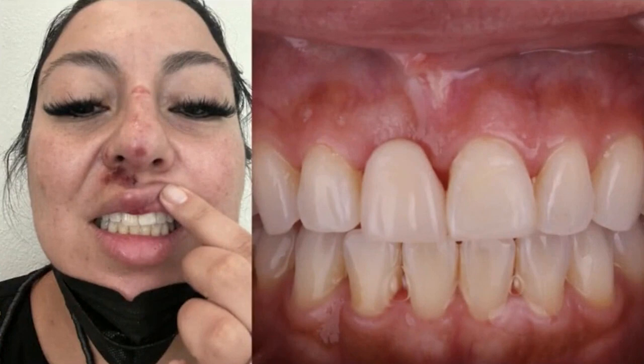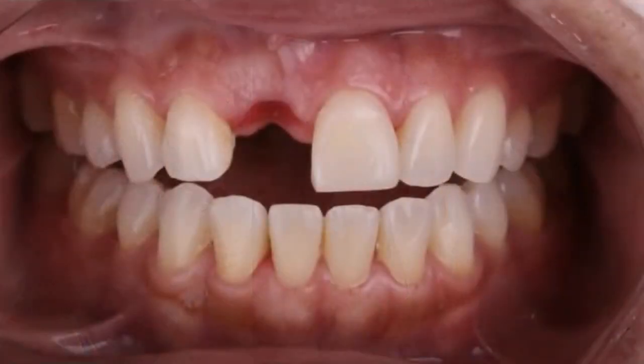My friends in Puerto Vallarta have the same technology that I have here in the U.S. They have the digital scanners, they have the printers, and they have a lab who does all this digitally. So they produced a flipper for her for the next day. This is when she comes to my office. The flipper was made perfectly fine. When we were discussing the flipper, I asked the doctor, can you please make it in a way that can train the soft tissue? And that's what he did.